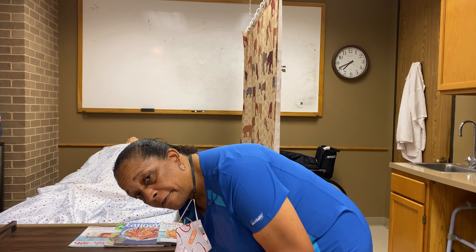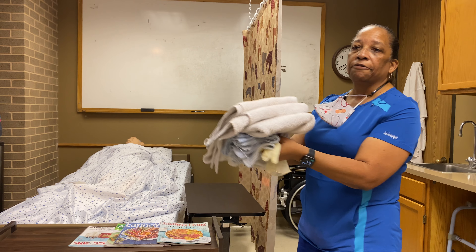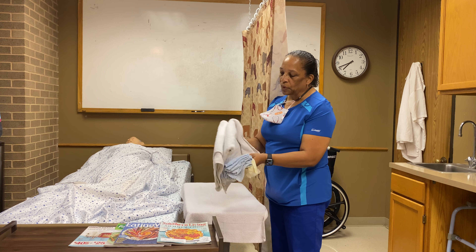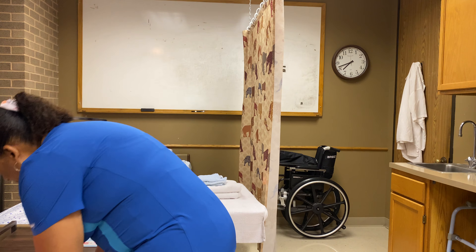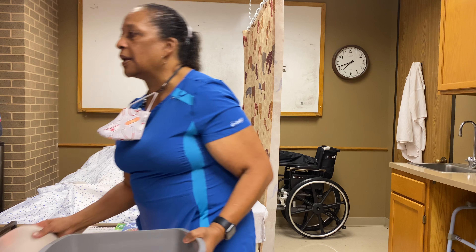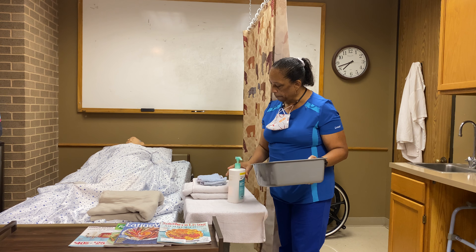Now that my hands are clean, I'm going to gather my supplies. I will need a pair of gloves, four washcloths, and three bath towels. I'm going to take one bath towel and put it on the table to act as a barrier to keep the patient's bedside table clean. I'll put the other two bath towels here, along with my gloves and four washcloths. I also need a bath basin with soap and a bath blanket so the patient can stay warm. I'm getting these supplies from the patient's cabinet in the room.